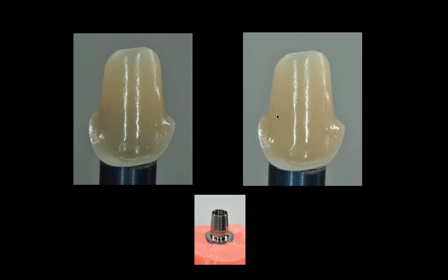You know, people say, I just use an opaque bonding material, but you forget that your gap is maybe only 50 microns, sometimes 40 microns, the thickness of a hair. And if you take the thickness of a hair and you try to mask it with the standard, let's say, Multilink Opaque, they're not opaque enough, and then it still shines through gray. So we have to do something else.